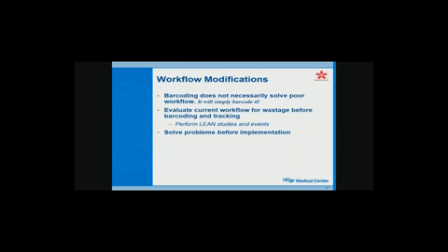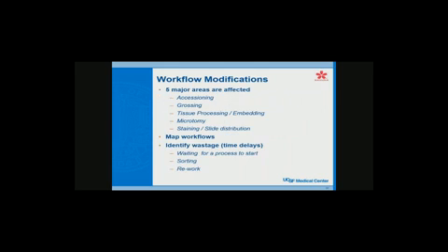So another thing to talk about in the preparation is workflow modifications. There's a saying, and we heard this from every single group that we talked to about barcoding in the years that we were planning for this: barcoding does not solve poor workflow. It simply barcodes it. So that's something to take to heart. If you're going to implement barcoding, take the opportunity to look at your entire workflow system and see where you're having wastage, and perform lean studies and solve problems before the implementation.